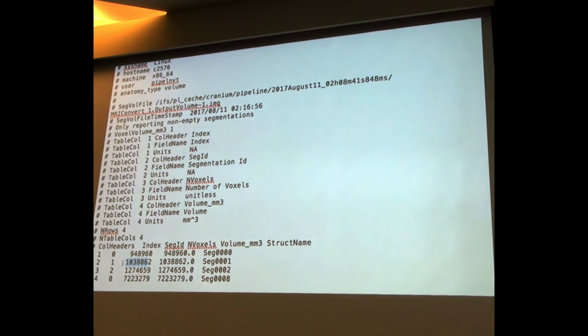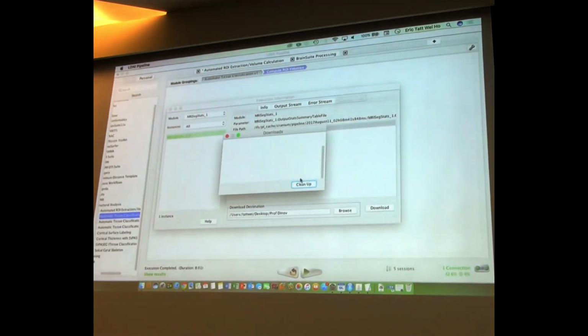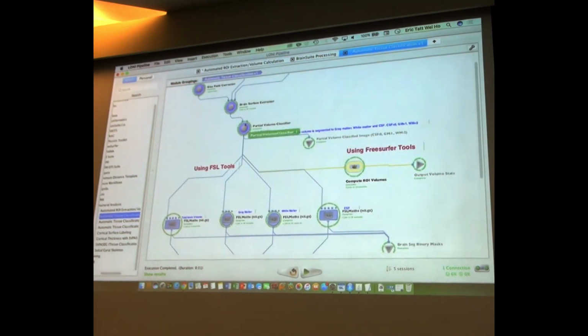One is background, and the other 3 tissue types. Now, to figure out exactly which one is which, we may have to, how do you exit from the full screen? Okay, there we go. So to figure out which one is which, we need to dive in the documentation of some of these tools that actually generate the partial volume classifier.